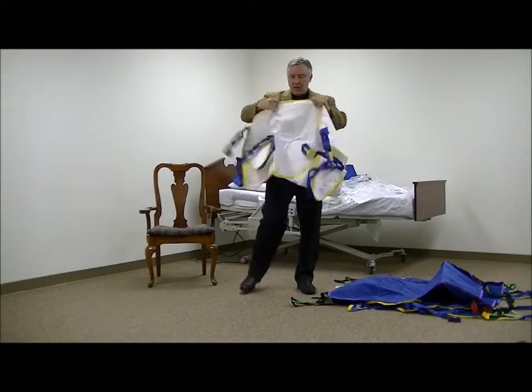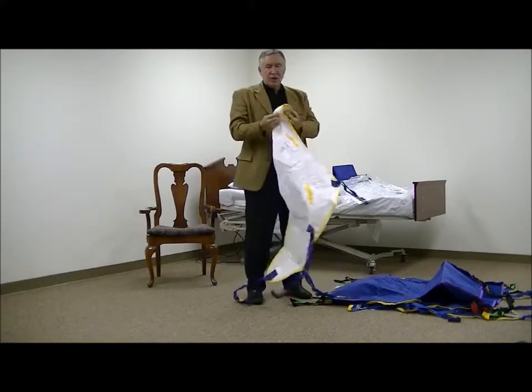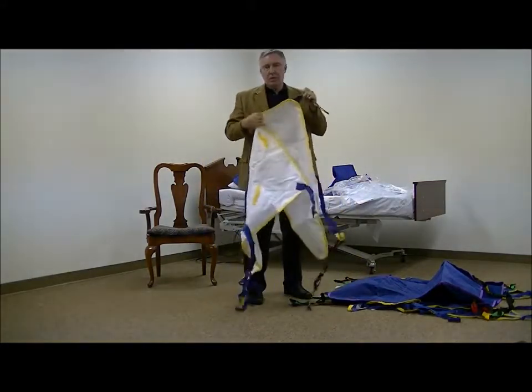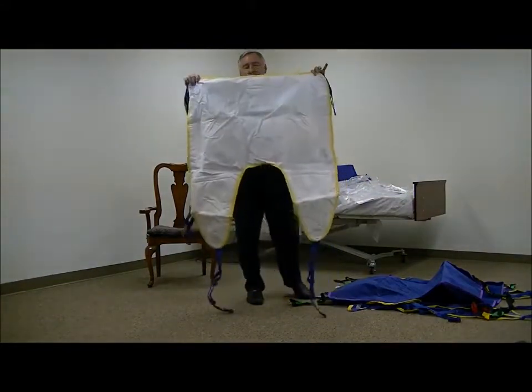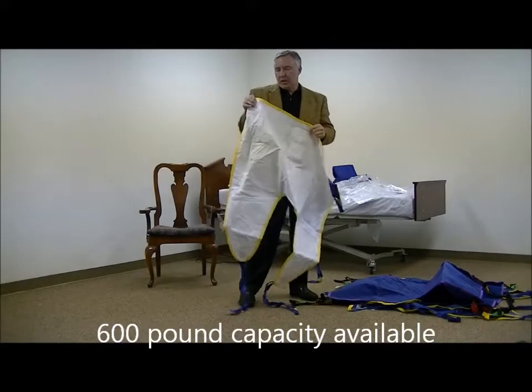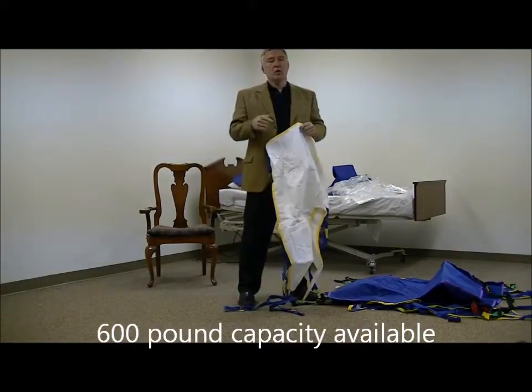Now I'm going to show you a sling that looks quite different than the others — in the white material. It's actually a non-woven material because this is what we call a patient-specific sling. This is becoming very popular in the industry because of the importance of infection control and the difficulty of managing laundry.